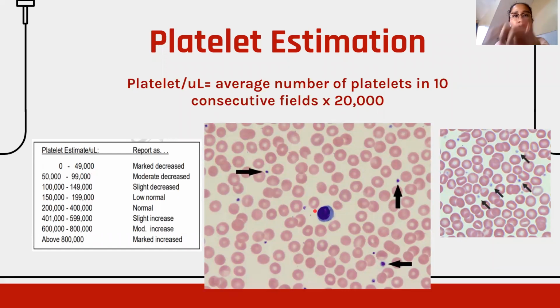And class, if you're going to zoom in, actually, may mga extensions or protrusions in your platelet. Those are actually pseudopods or false feet. Parang may mga extensions ng mga buhok eh. Pseudopods or false feet.